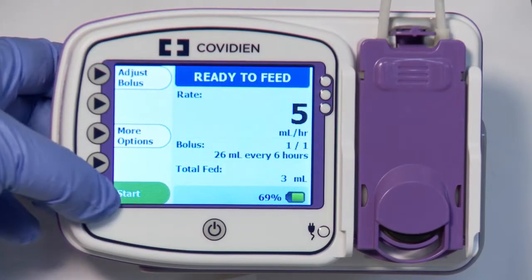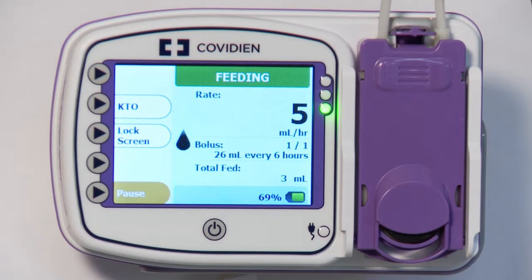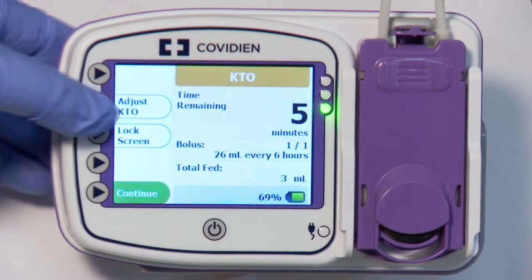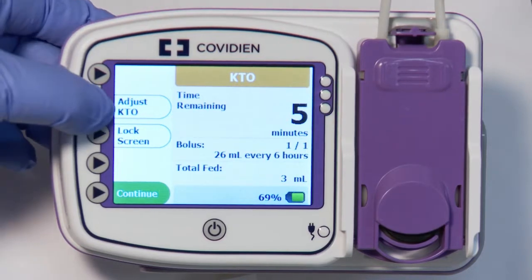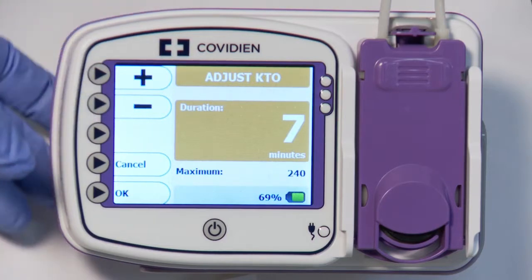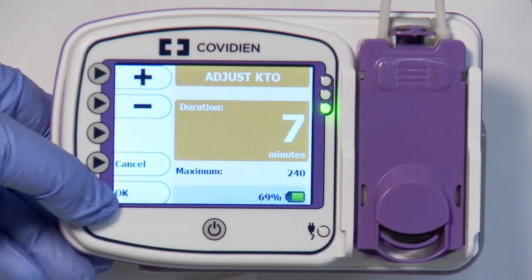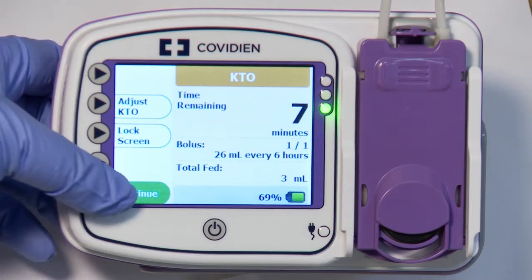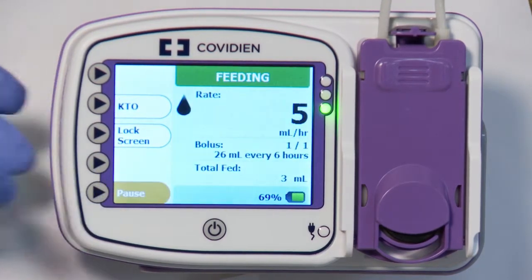Activate the KTO feature during the feeding cycle by pressing the KTO button. The feeding will be paused. You may adjust the duration of the KTO session on this screen. When finished, select OK. To unpause the pump and resume feeding, select Continue.